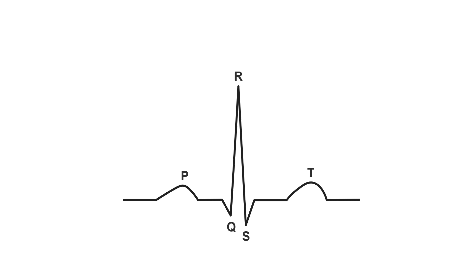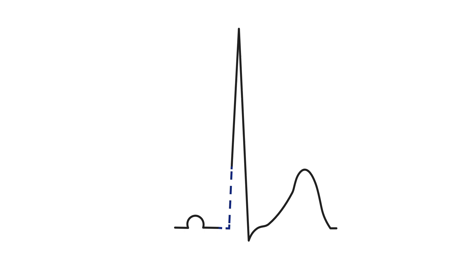Also, what we look for at the start of the recording is whether the waves and intervals have normal durations. Is the PR interval normal? Are the QRS duration and the QT interval normal? Are there any baseline abnormalities evident, such as the delta wave and a short PR interval of Wolff-Parkinson-White syndrome?